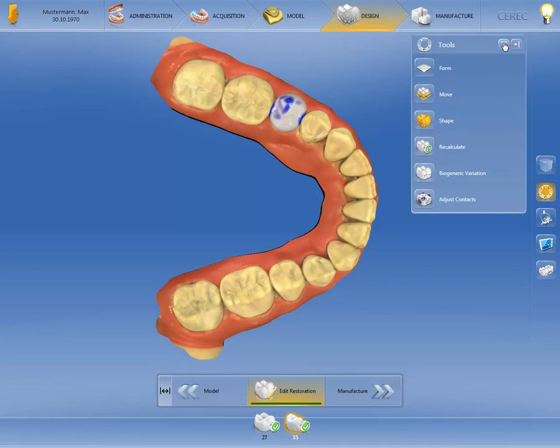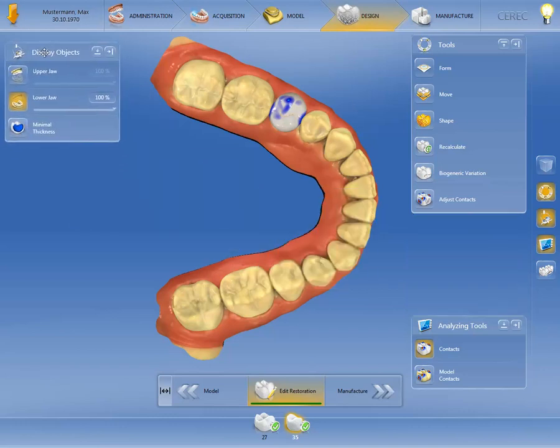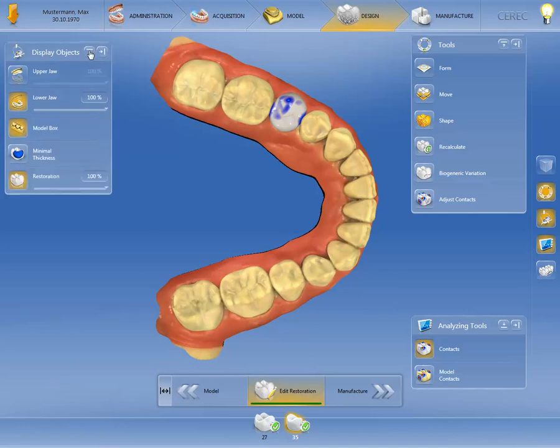Multiple windows can also be opened at the same time in order to edit the restoration. The side windows can be moved for optimum positioning on the screen — hold the left mouse button down on the window title and move it to the desired position. The CEREC software makes a note of this setting for subsequent restorations. Click on Minimize as required to close the side window.